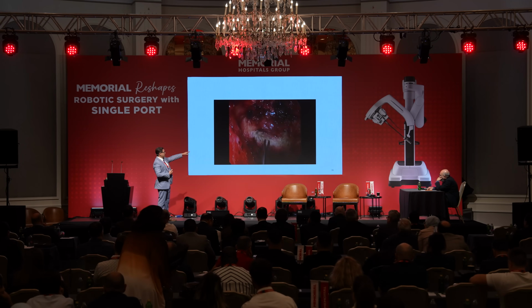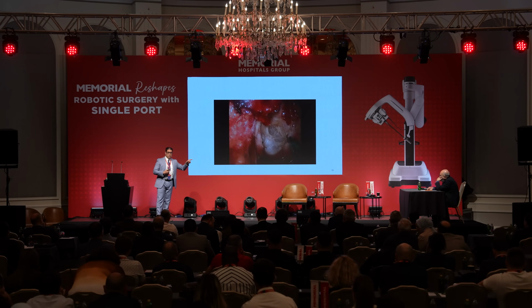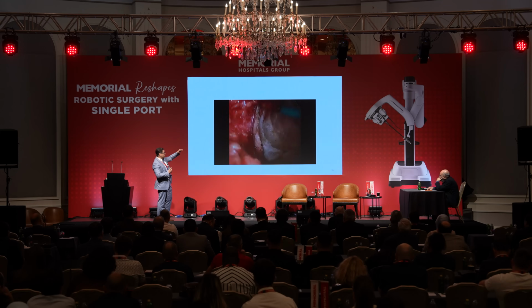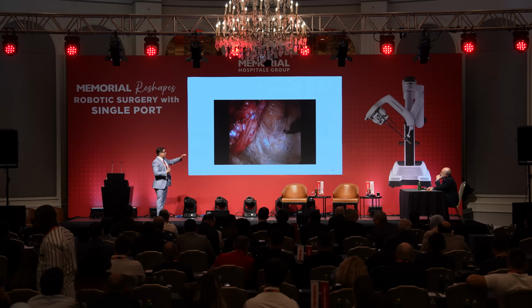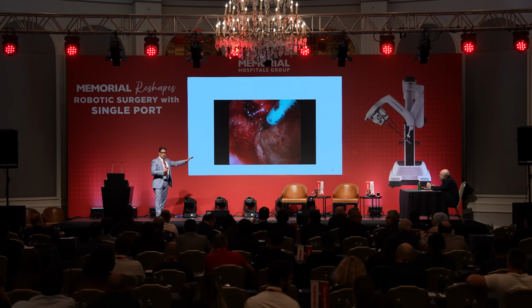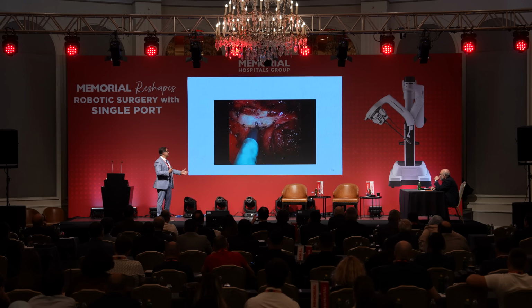And here I'm entering the real pelvis, and there I'm entering the fascia of Waldeyer in reverse, okay? And the same thing I tell my fellows from the abdomen: you stay between the fascia of Waldeyer and the mesorectum, you stay also here. And my point of this is I'm going to do complete rectal dissection from the pelvis to save my energy to do only the colon and IMA from the abdomen.